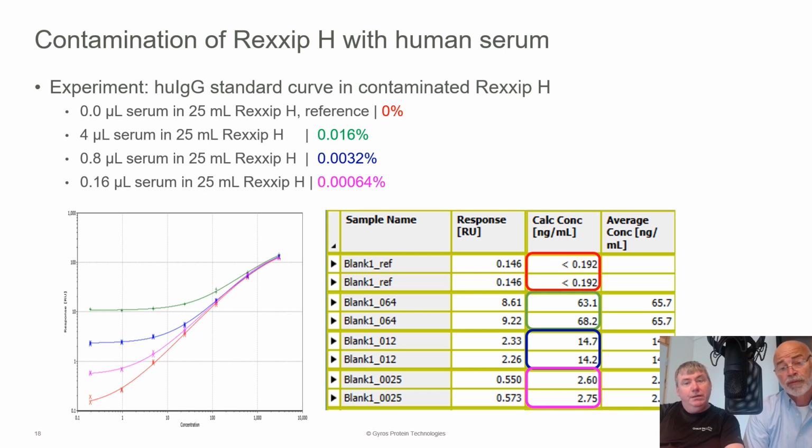Yeah, and so this really illustrates the same problem you'd have with some sort of a carryover. The more sensitive your assay is, the more opportunity there is to sort of create a carryover problem with just very minute amounts of sample getting somewhere where it shouldn't.